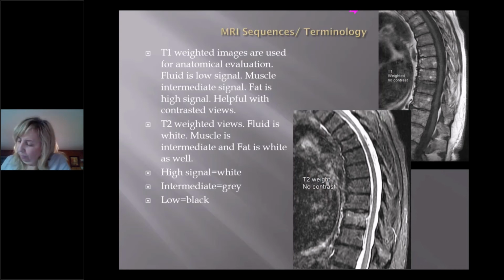And that's where MRI can be helpful. If you got an X-ray and it said, hey, fracture of T whatever, age indeterminate. We don't know if it's old or new. And if the patient has pain, there's the key. If they get a broken bone, they're going to have pain. If the patient has pain there and you see an abnormality on the X-ray, it's worth getting the MR to try to ascertain the acuity of the fracture. Then you can decide, hey, is this fracture recent? Is this something I have to take care of? Or is this an old fracture and life is good, have a nice day, leave them alone? So it makes a big difference there as to how you're going to treat that or not treat that.